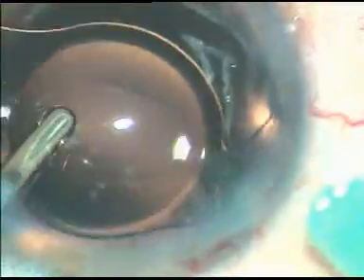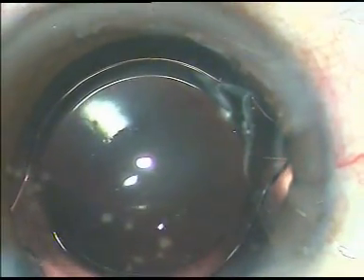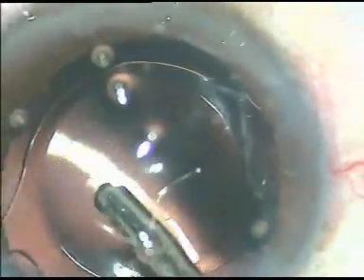Under irrigation, an IOL is implanted. The irrigation probe is used to dial the lens and place it in the capsular bag. There is some amount of viscoelastic substance in the lumen of the cartridge that is washed out.